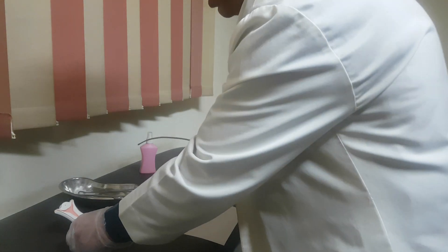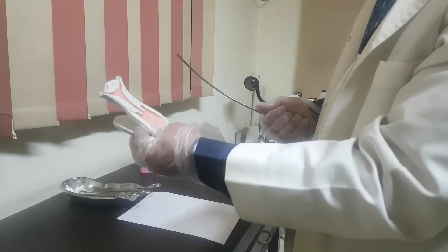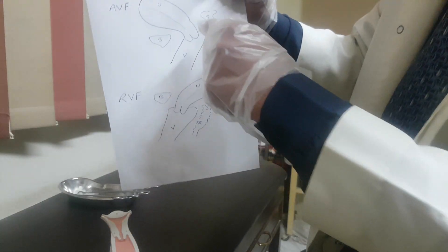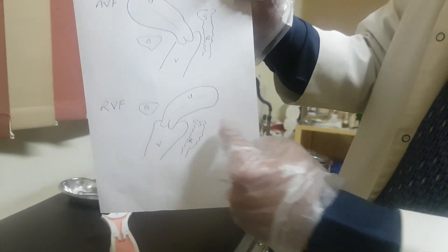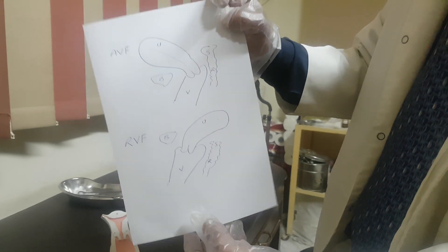Let us start uterine sounding. The indications for uterine sounding are: to measure the length of the uterine cavity and to know the position of the uterus — whether it is anteverted flexed (AVF) as in this picture, or retroverted flexed (RVF) as in the lower one. So this is AVF and this is RVF.